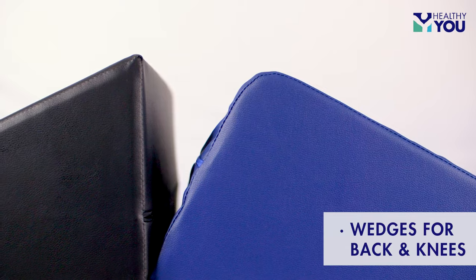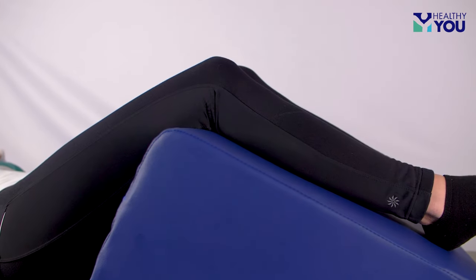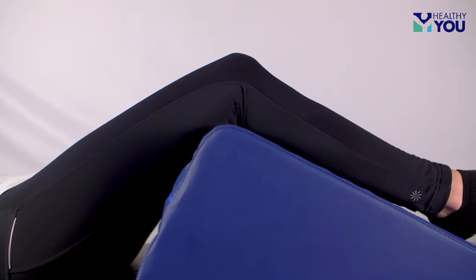We also have two style wedges for back and knees. The back wedge was designed to elevate the patient in the semi-upright position. The knee wedge has a different angle that is perfect for comfortably elevating the legs.